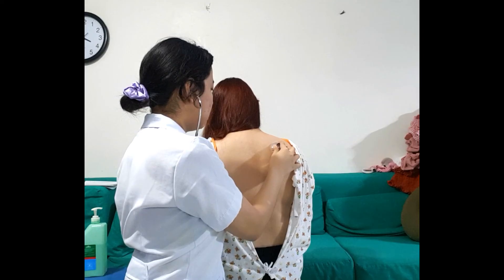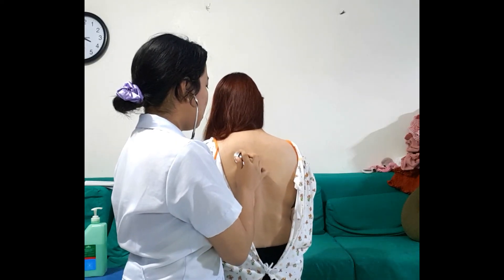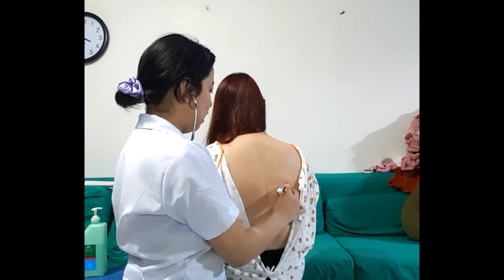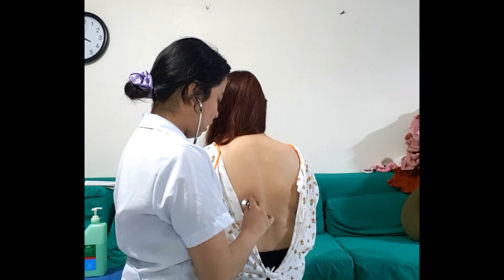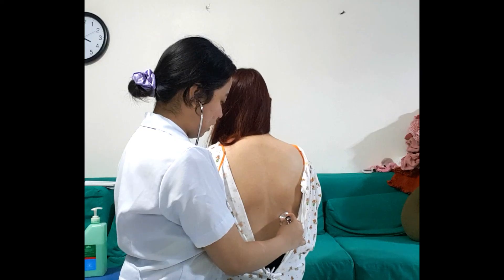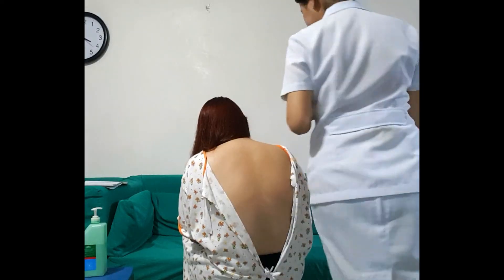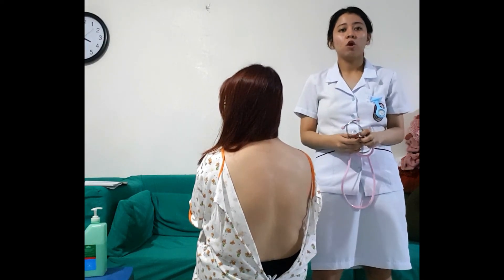Ma'am, can you take a deep breath? Inhale, exhale. Inhale, exhale. The nurse auscultates across the posterior chest in the zigzag pattern, instructing the patient to inhale and exhale at each position. The sound during inhalation and exhalation is the same, which means it is normal.